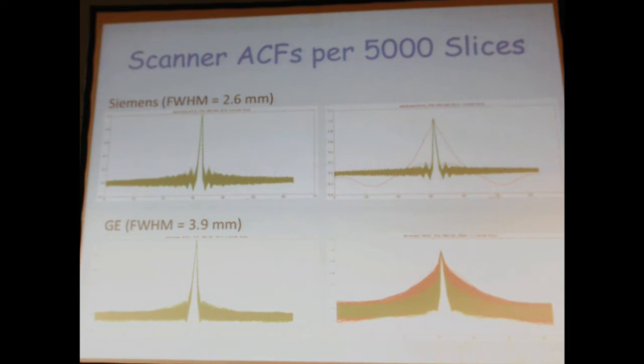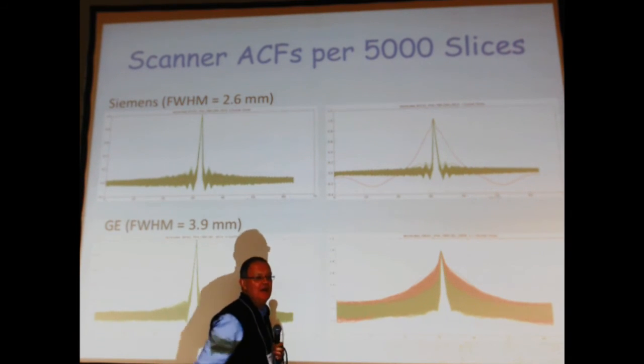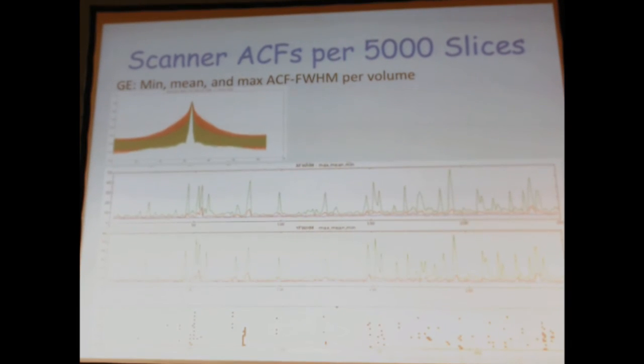And on the left here you have two well-behaving sessions, giving standard stuff. On the right here, you have a Siemens scanner where just one slice at one TR decided to have a little fit and just did something weird. At the bottom, we have a GE scanner where lots of slices decided to do weird things. So now the issue is, how do we quantitate that effect? This is one way. So this is the GE.